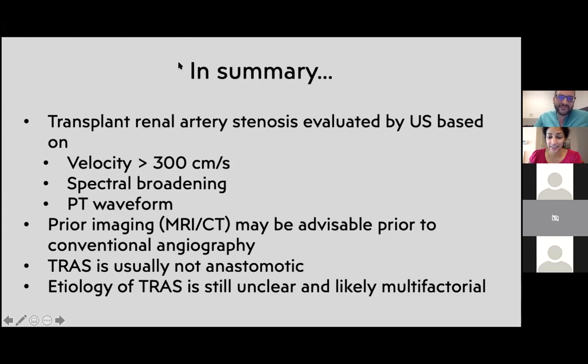Hey, what about contrast-enhanced ultrasound? Since you have the patient in your lab already, why not use that to troubleshoot these potential stenoses? Yeah, very good question. It's a possibility. We have noticed in some patients that we're able to see it. We also use B-flow. We found that to be quite helpful in trying to look for a stenosis. It doesn't pan out as well as MR angiography, just in my opinion. I think it's a useful tool to try out. If you can see it and you can have confidence in it, that's great.